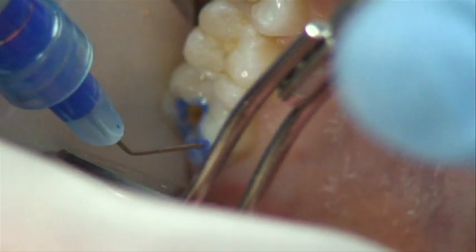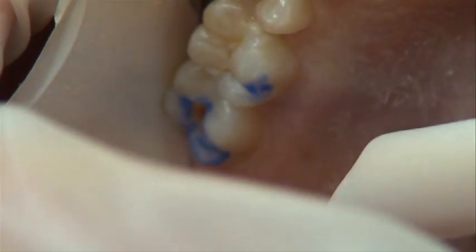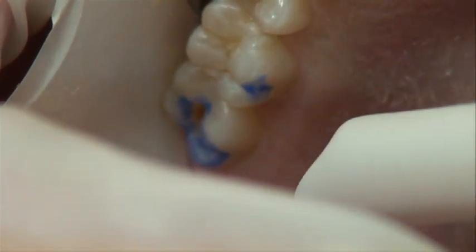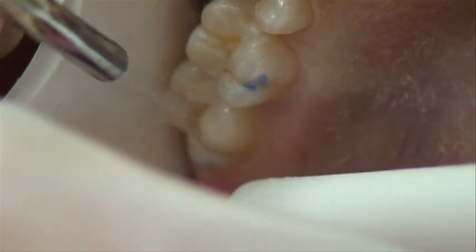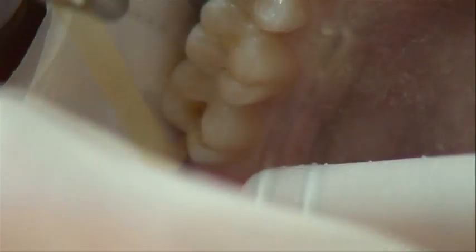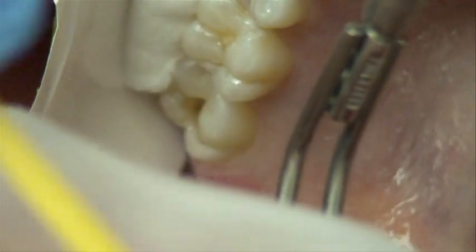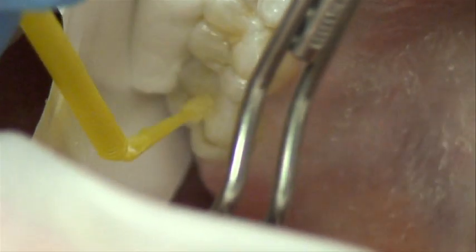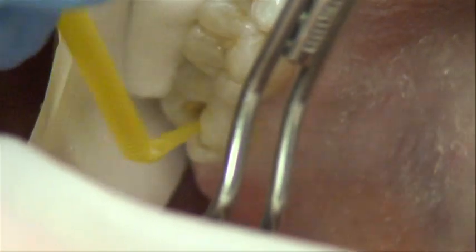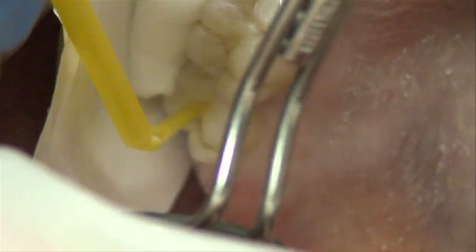At that point, that's the only time when you're sure that you got rid of the solvent. Right here you see the application of the etch, and of course that's going to be a quick application of the etch. We want to etch the enamel selectively, not the dentin. We're going to wait about 10 seconds, and then we're going to wash the etch. And of course, you want to be careful not to etch the dentin. You're only etching the enamel. Then wash, dry. You apply the primer, and we already talked about it. You keep applying it, you keep rubbing it, especially on the dentin, but you're going to apply it also on the enamel. And 20 seconds, make sure that you get rid of the solvent really well.